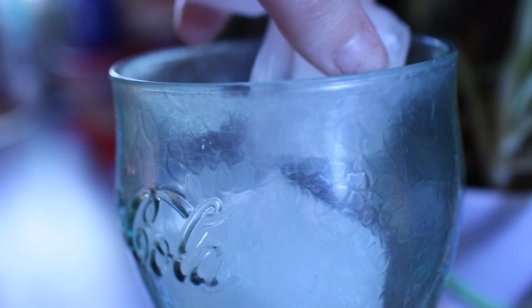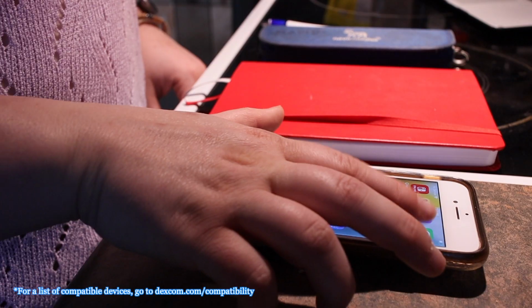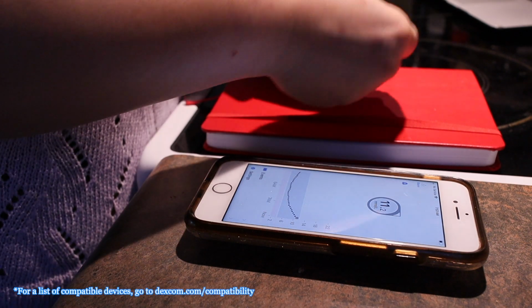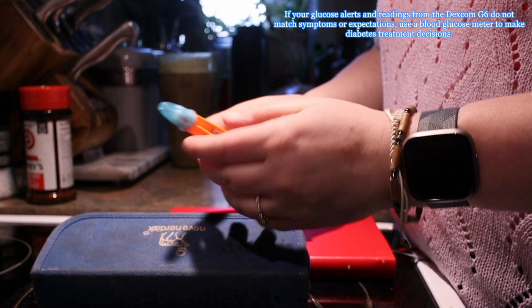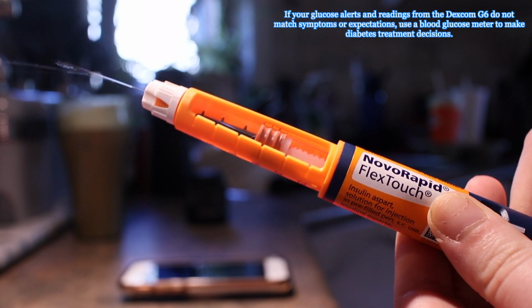Good morning, friends. First thing I do after I put the doggos out is make a coffee. I am literally obsessed with hazelnut Nespresso iced coffee, which I take with 2 sweeteners and a splash of milk. After I feed the dogs, I check my glucose levels, and this particular morning I was a tad high, so I did take a correction bolus along with my morning basal dose of insulin.